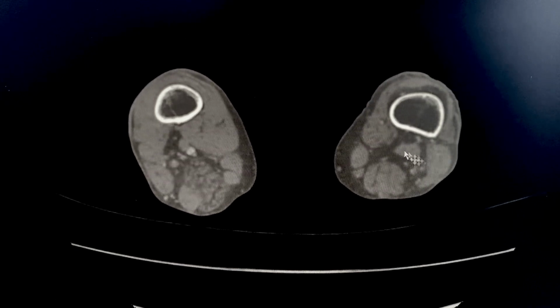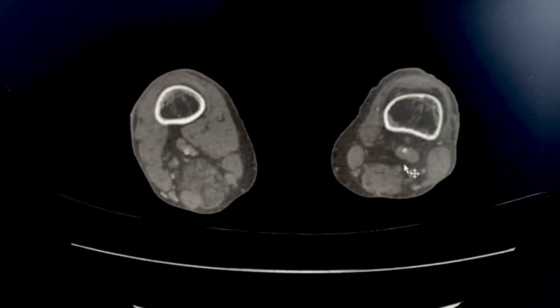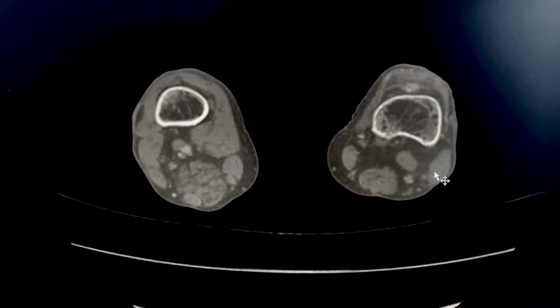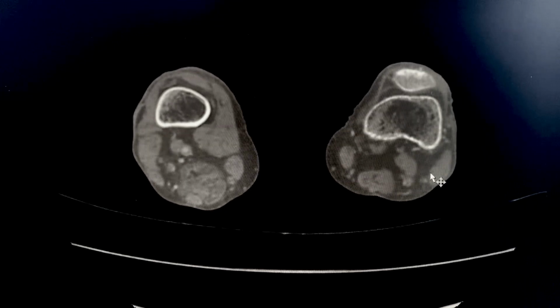But on the left, it's totally and absolutely occluded, right? And then here you can see some contrasting begin to show up. Now, and then we continue.